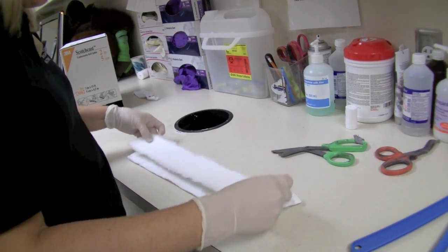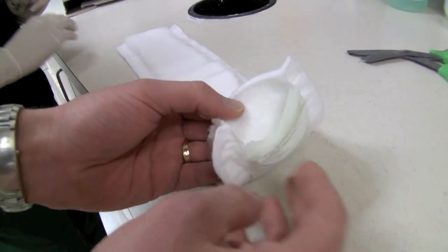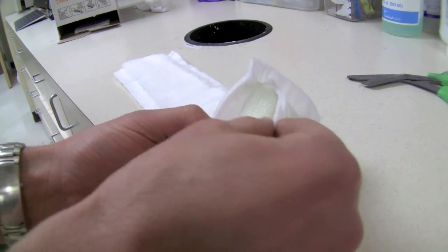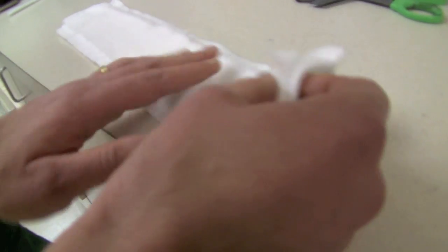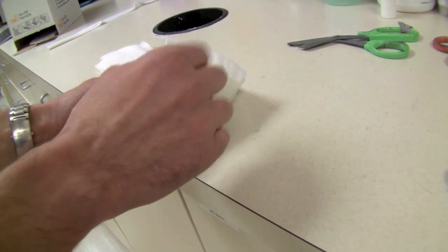That's where the padding is going to go, and the padding orientation is not always intuitive. You can see that the fiberglass casing is asymmetric — you've got a thin side and a thick side. The thick side is what goes against your skin, along with the extra padding. The thin side goes to the outside world.